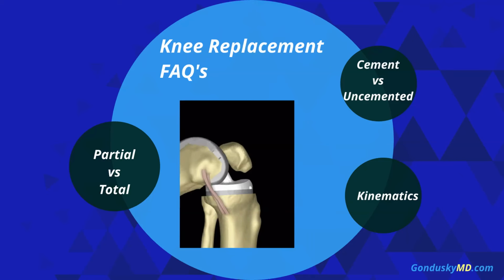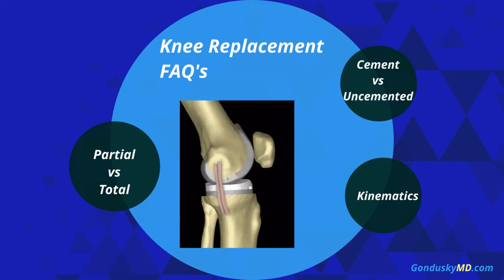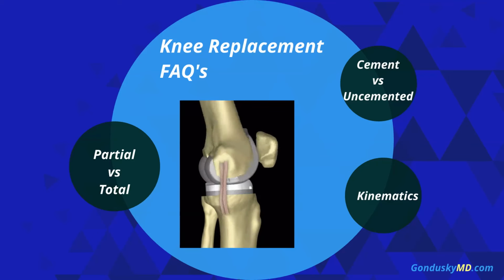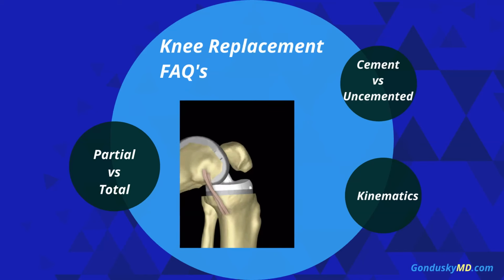Generally we never need MRI or CT scans for a knee replacement because we can see the anatomy on an X-ray, and so we know everything about the bony anatomy based on the preoperative X-rays and also the soft tissue anatomy based on your exam. Therefore an MRI or CT scan is incredibly rare to need before a knee replacement because it just does not help us at all.